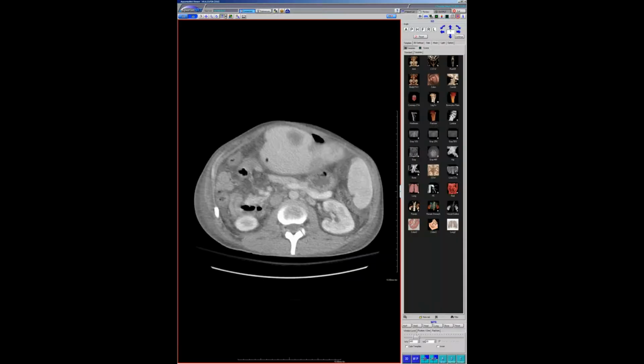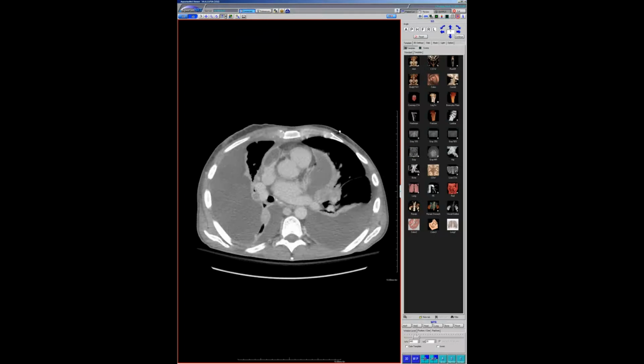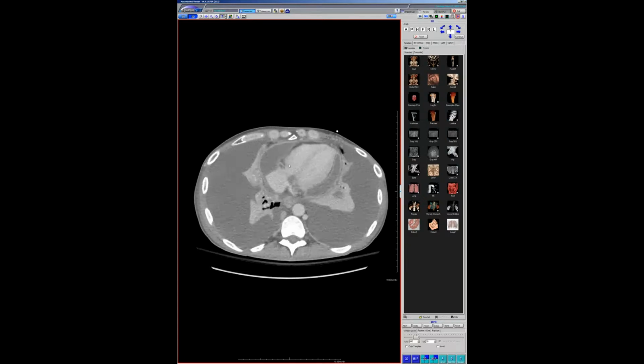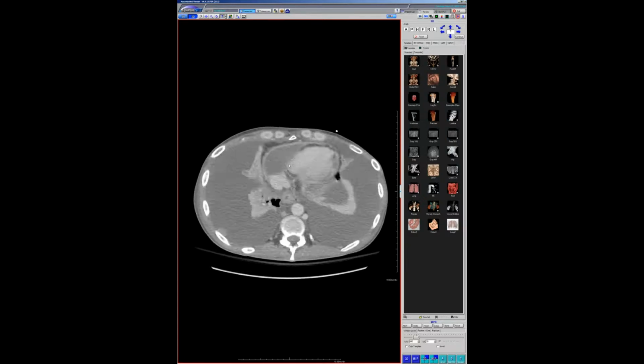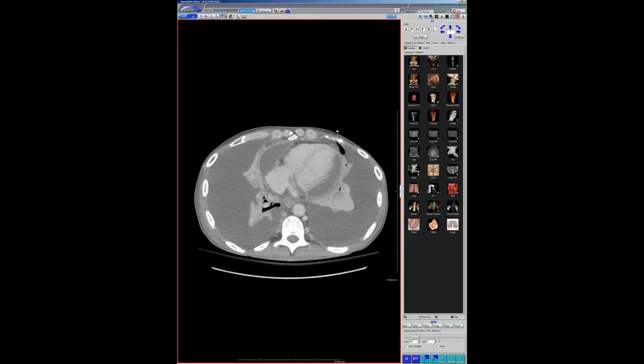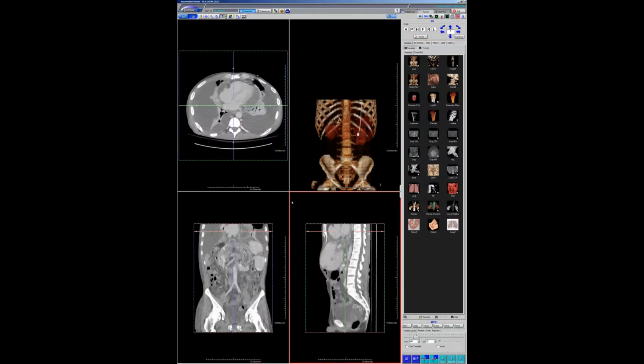Anyways, let me show you the belly study, because I think, again, the advantages of portal venous phase are really, when you're especially looking at the pericardium, quite amazing. So you can see that this is a very nasty pericardial effusion. I thought it was going to be a tumor in here, causing this kind of inflammatory pericardial inflammation. It turns out that they tapped this thing and got out Klebsiella and some other species. So it was actually an infectious pericarditis.